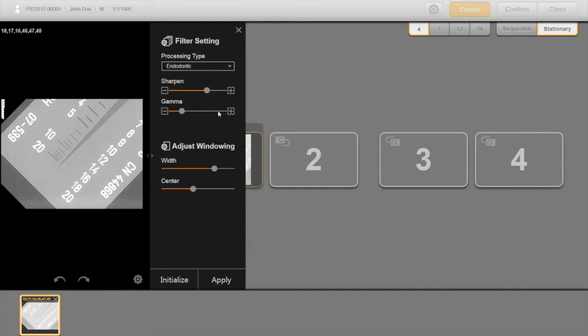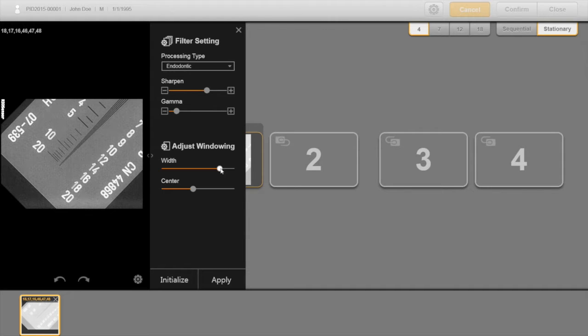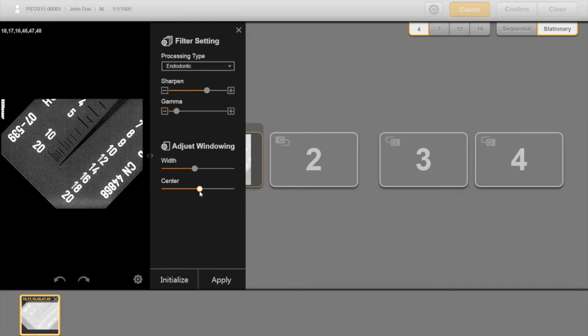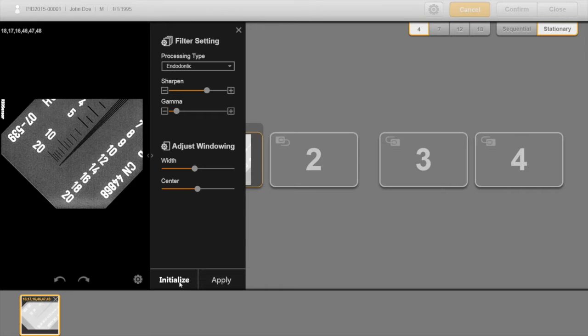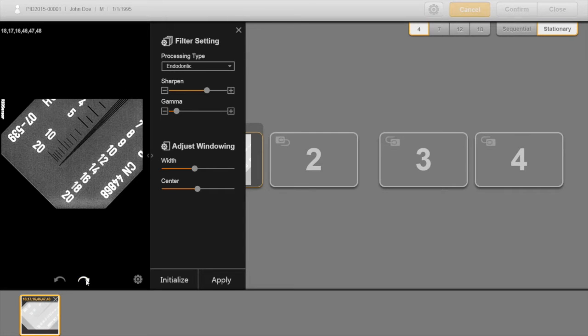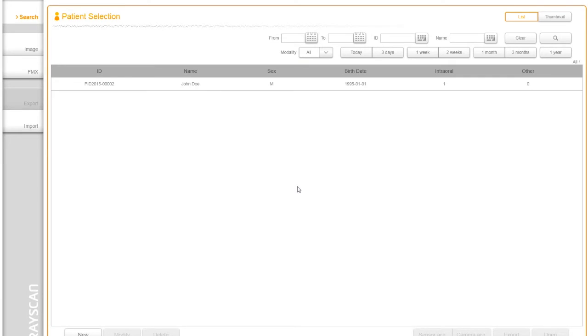The Gamma button is similar to standard brightness adjustment, but it is a more powerful enhancement. Gamma dynamically changes image pixels so that there is always a relative brightness difference between them. This ensures the changes in density within the image will be maintained, as opposed to all pixels becoming white or black. You can also rotate the image to the left and right. To reset the filter back to its original setting, click on the Initialize button. Note, the adjustments can be modified anytime needed before saving the final images.